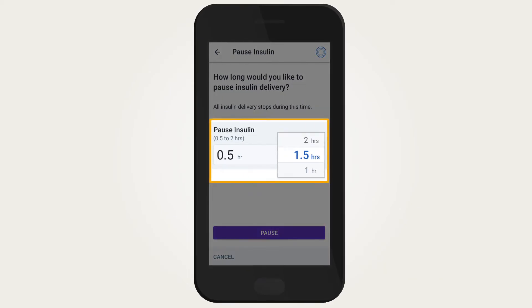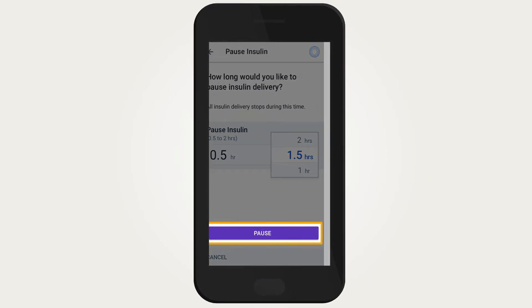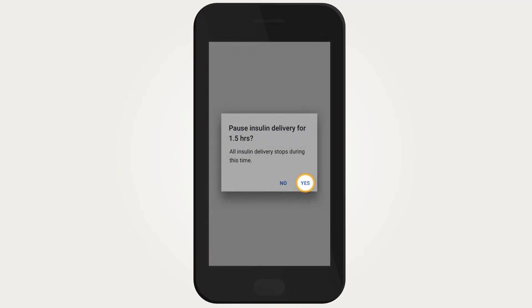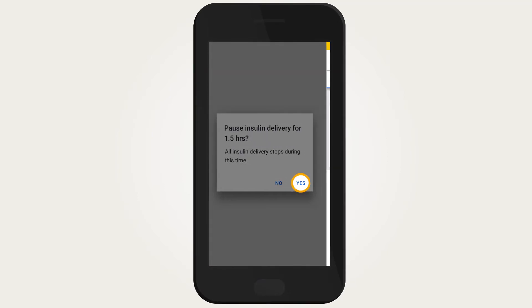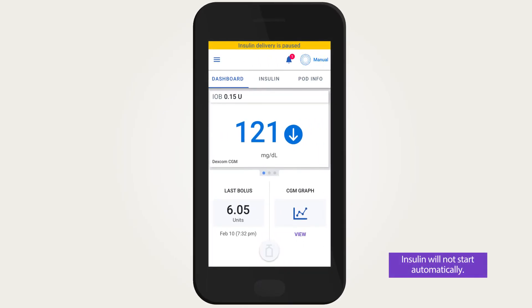Tap on the pause insulin field to choose how long to pause all insulin delivery, then tap pause. You will notice a yellow banner showing you insulin delivery is paused. Insulin will not start automatically at the end of your chosen duration — an alert will remind you to start insulin delivery again.